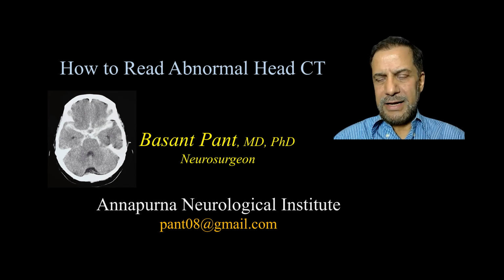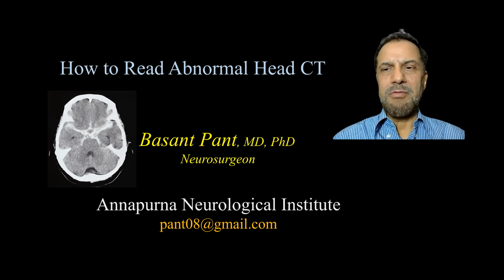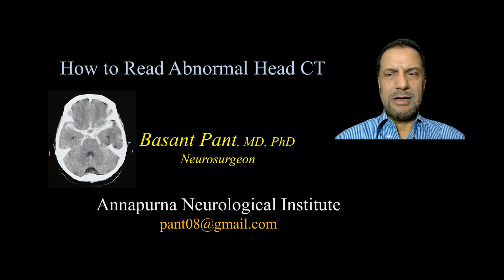Having said that, reading CT scan is important for all of us, medical students and medical doctors, irrespective of whatever specialty they are in, because it has become such a common investigation that you can interpret your own CT scan to some extent.